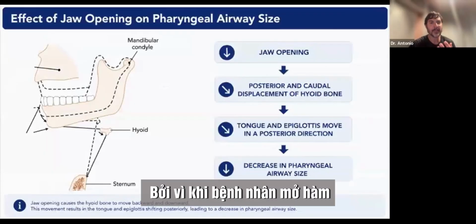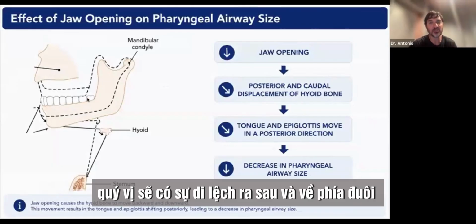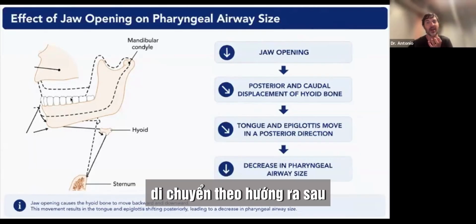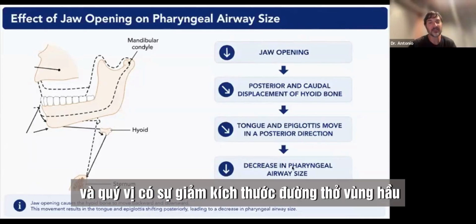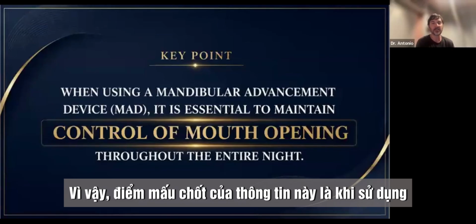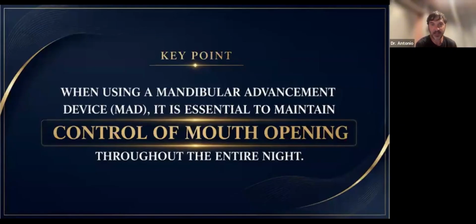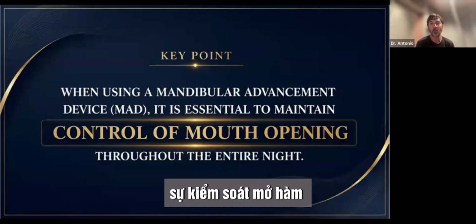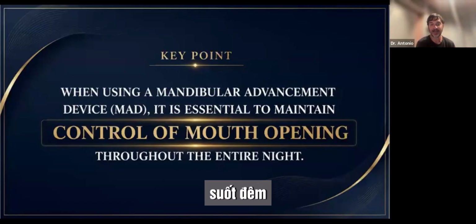Because when the patient opens the jaws, you have a posterior and caudal displacement of the hyoid bone here. So the tongue and epiglottis move in a posterior direction, and you have a decrease in pharyngeal airway size. So the key point of this information is that when using a mandibular advancement device, it is essential to maintain the control of the mouth opening throughout the entire night.